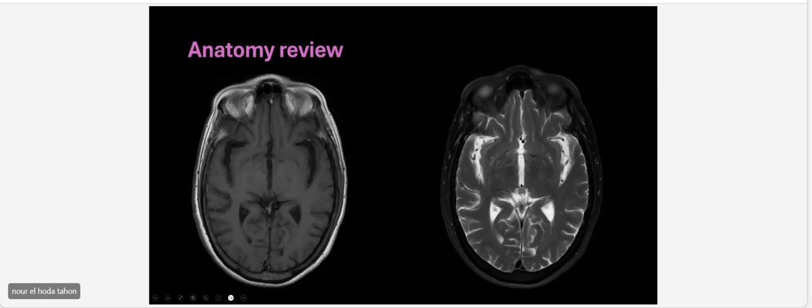So this patient, I can say, is probably older than 60 years because I can see the sulci and the ventricles are more prominent than in a younger age. So this happens with aging. The brain starts to atrophy, the ventricles start to be prominent because they take the place of the brain tissue, right? And the sulci and subarachnoid spaces also start to be prominent, and this is expected with age.